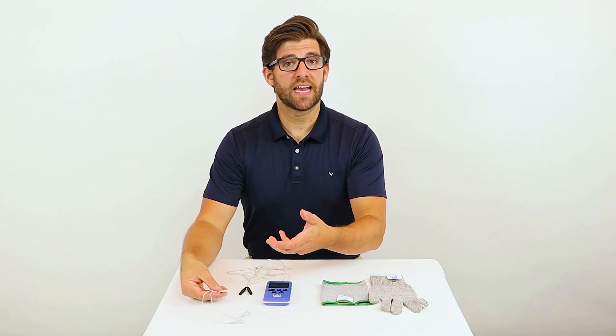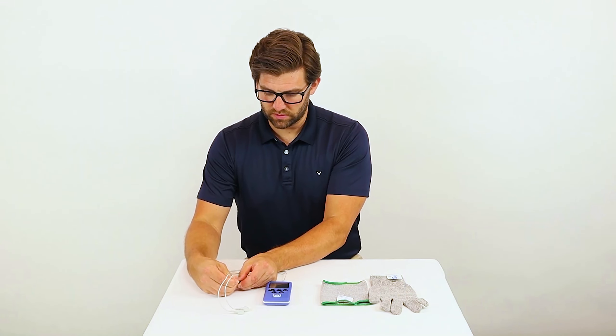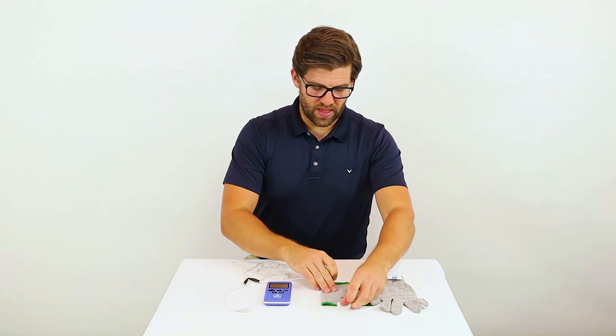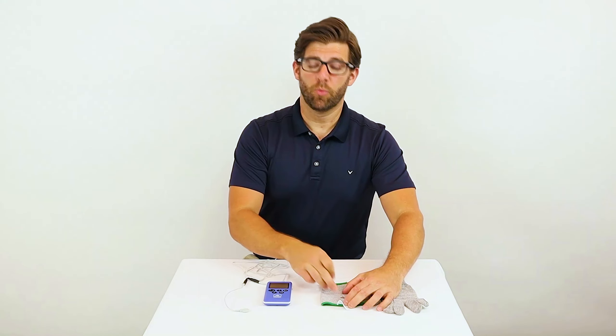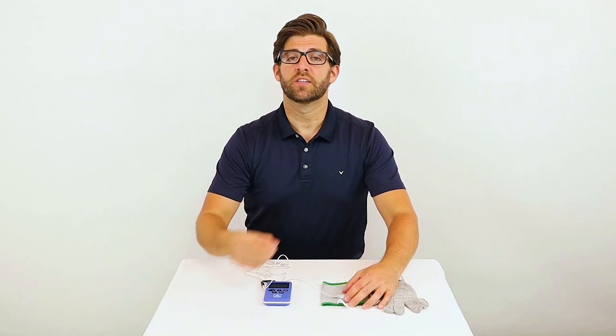To snap on the connectors, first plug them into the prongs on your lead wires. Then locate the snap on your elbow garment or your glove and push down until you hear it snap into place.